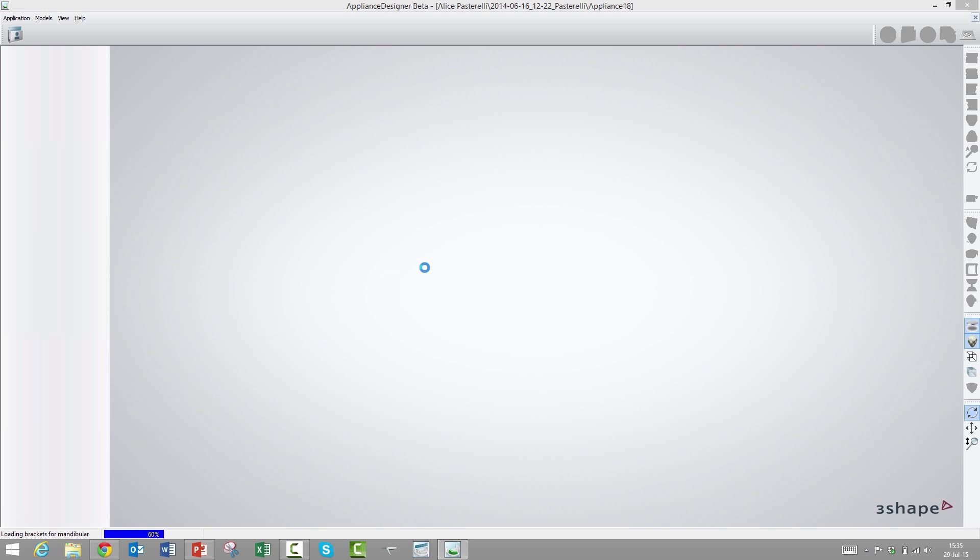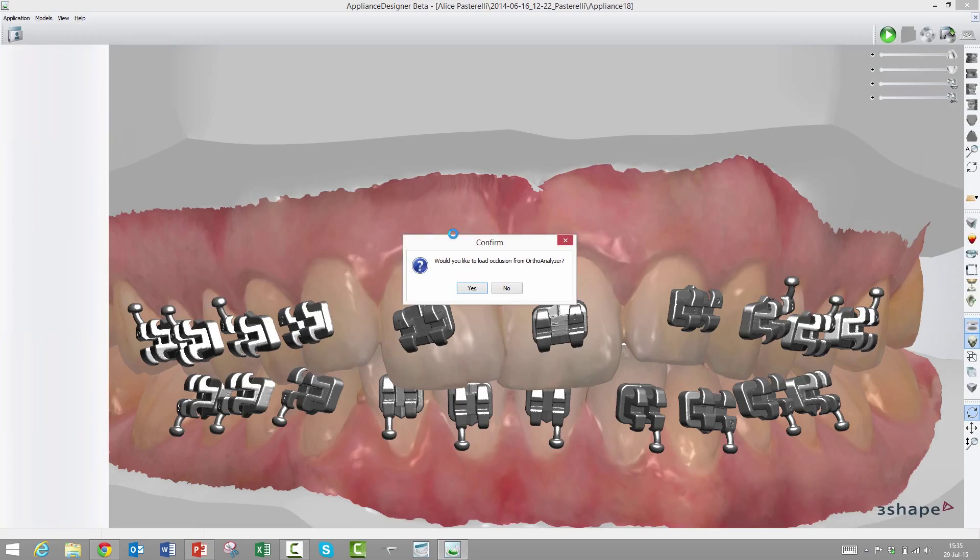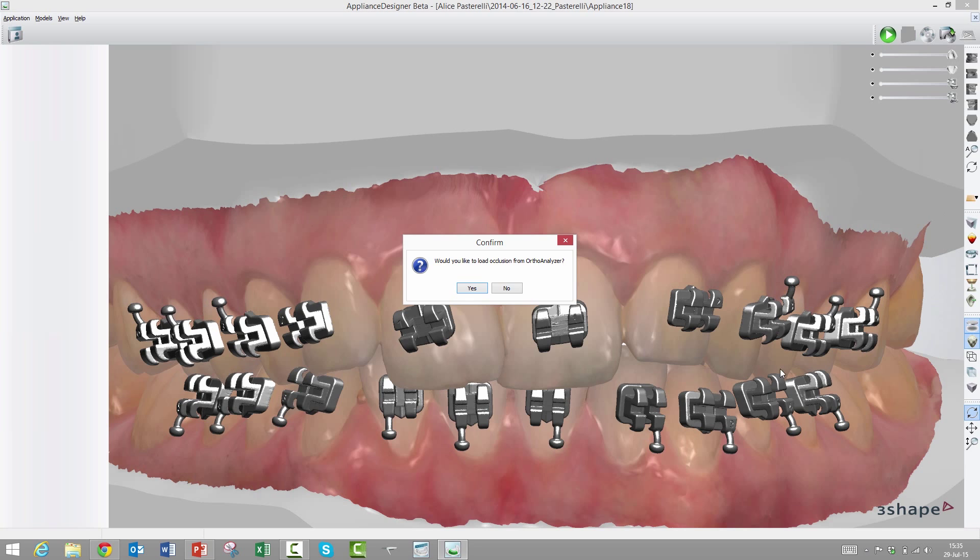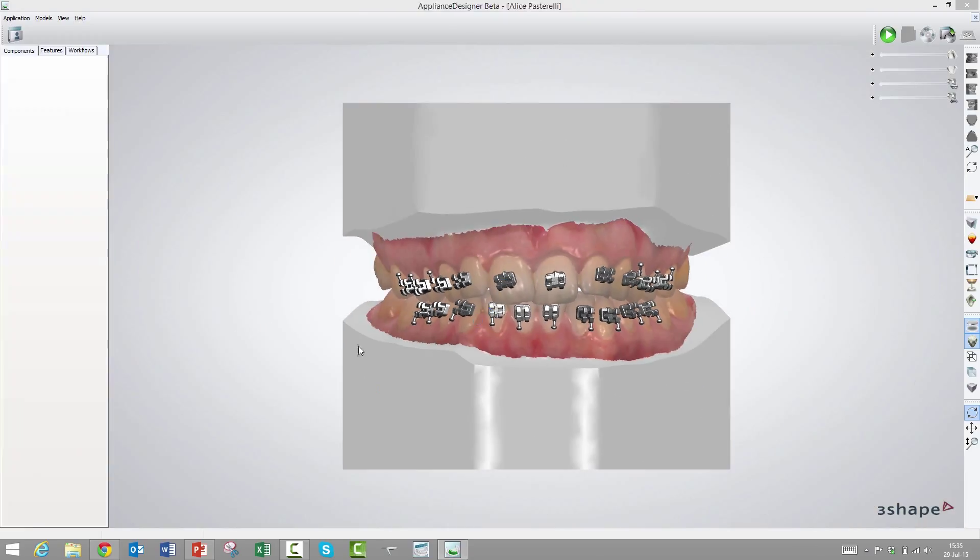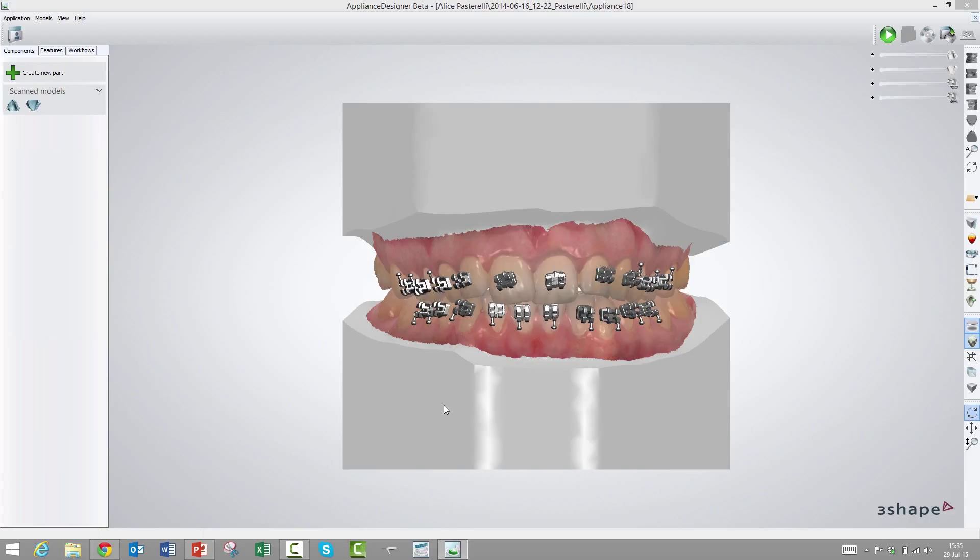We'll press create. In the lower left corner, it's loading the brackets. If it wasn't validated, that wouldn't happen. It will ask us if we will load the occlusion from Ortho Analyzer, and we will do that. This is a case where some of the brackets on the mandibular are colliding with the maxillary. We could load a different occlusion to circumvent that. The software supports this.